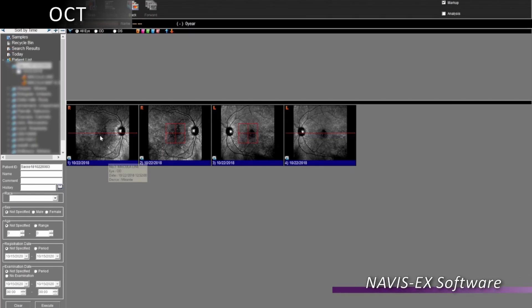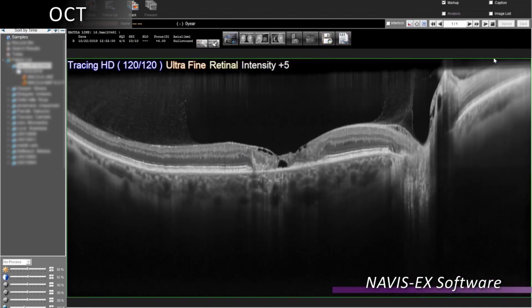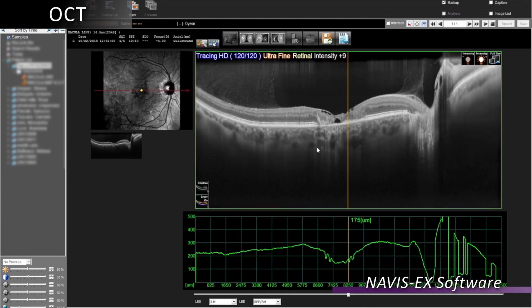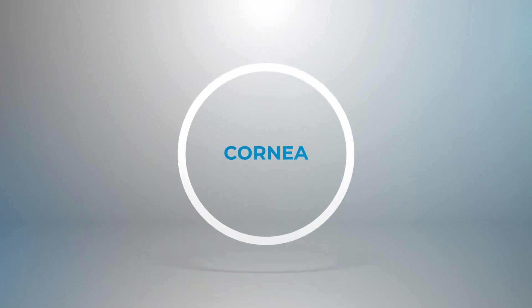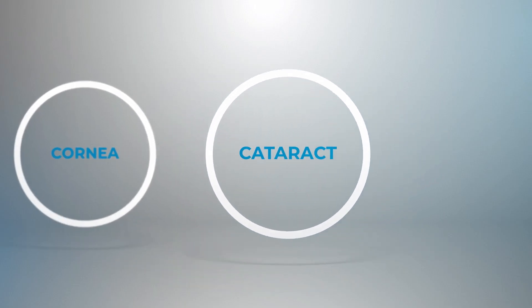In addition to the SLO, Marante provides high-resolution OCT images. This is a 16.5mm length B-scan image. Again, I thank you very much for your attention today.